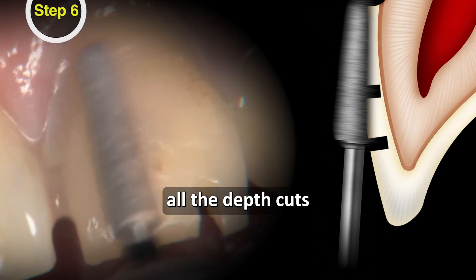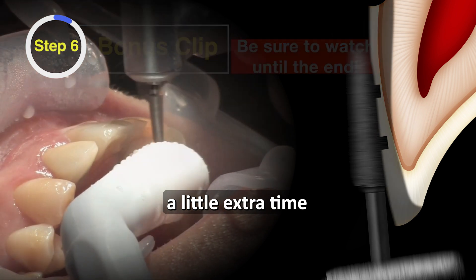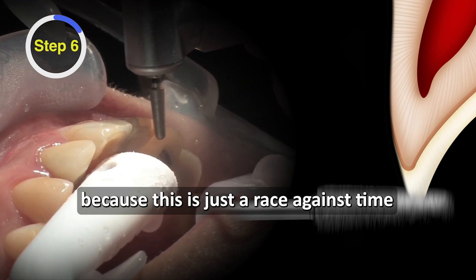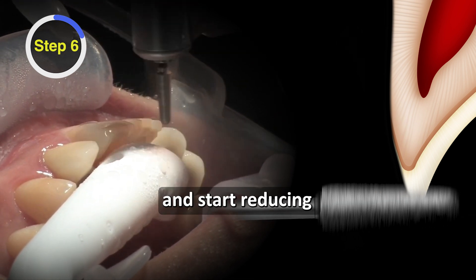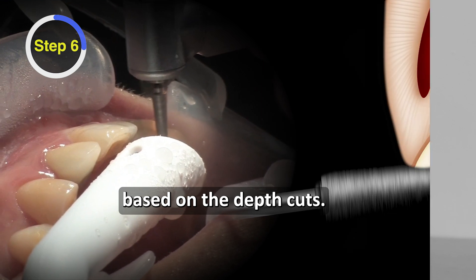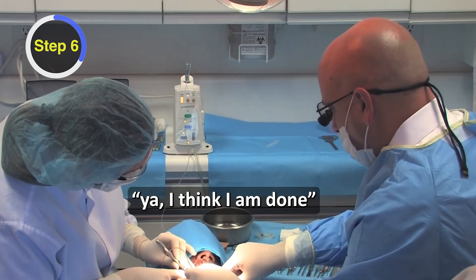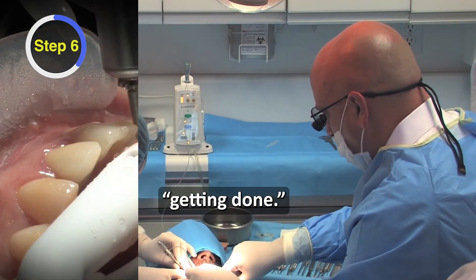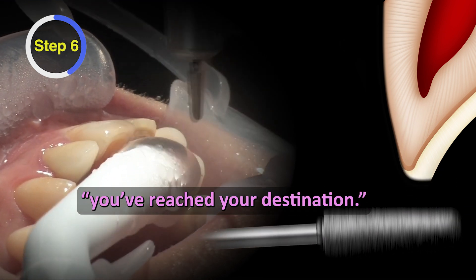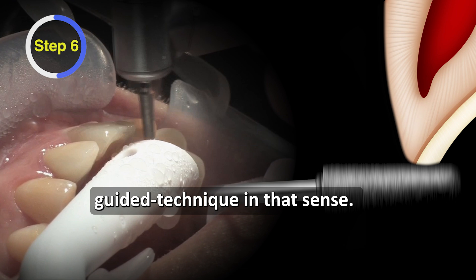We've got all the depth cuts where they need to be, and it's just time to blend all of these. Even if it seemed like we took a little extra time putting these depth cuts in, this is where you're really free to fly — it's just a race against time. Grab that 856025 and start reducing. It's a lot like having Waze or a GPS unit on your phone — you know when you're done. Based on the depth cuts, I know exactly when I've reached my destination. It really does feel like a guided technique in that sense.